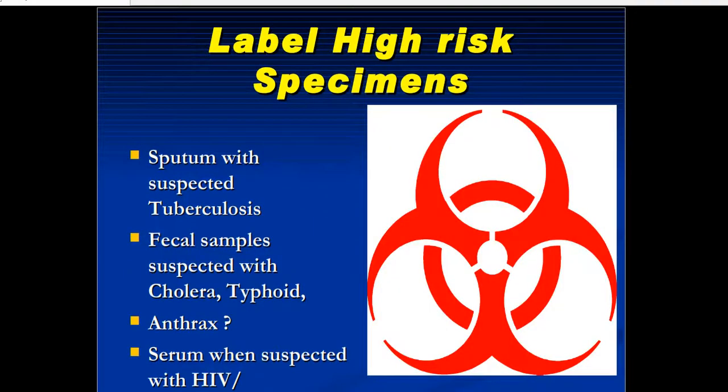After collection of the sample, you have to label it as a high-risk specimen. When transporting from the ward to the lab, label the sample if it is a high-risk sample. Blood samples, sputum samples, fecal matter samples, and urine samples are all highly contaminated, high-risk samples. They should be closed in a leak-proof container, an appropriate container should be used for collection, and the container should be labeled as a high-risk specimen when transporting.